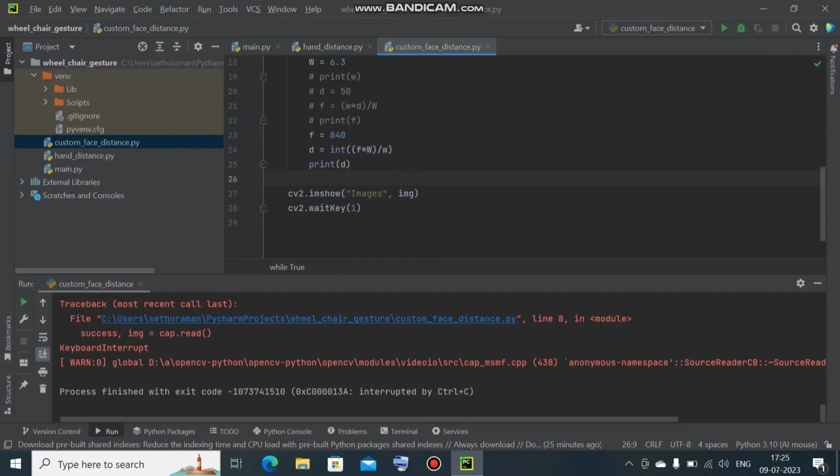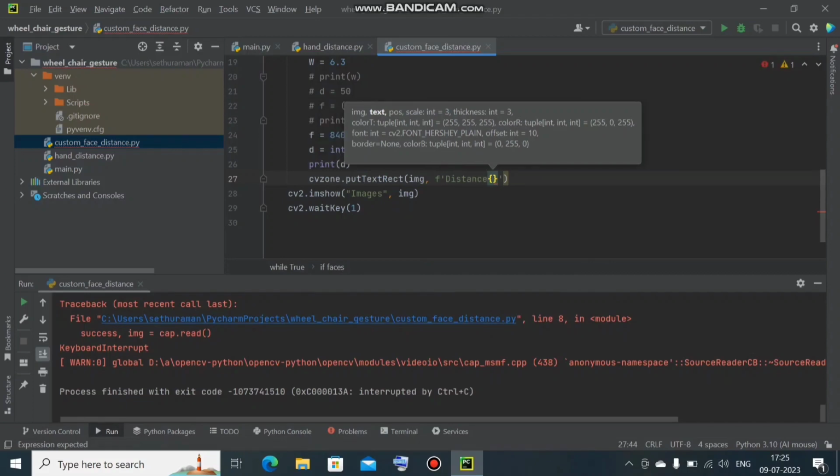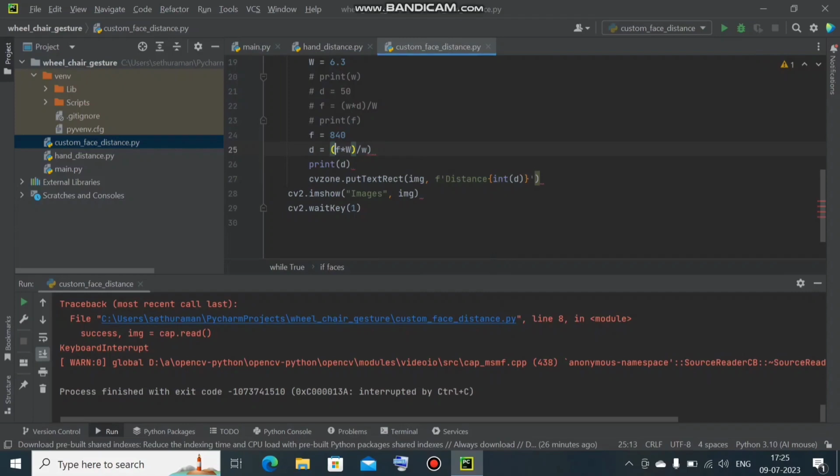Instead of printing in the terminal, we need to display that result on the screen itself. So for that we can use cvzone dot putTextRect, comma, f distance of, we will make it an integer here, so not here. We can make it there also, but we will collapse with the formula. So let us make it here, then centimeter.